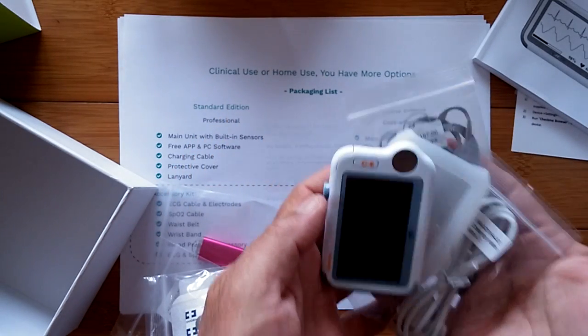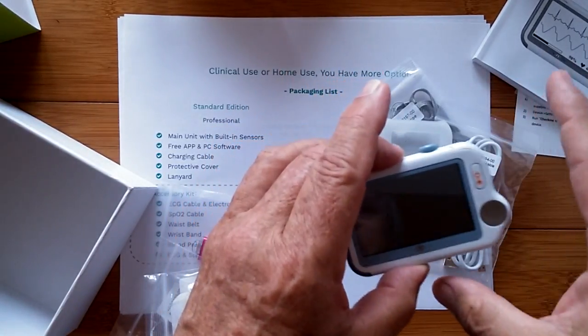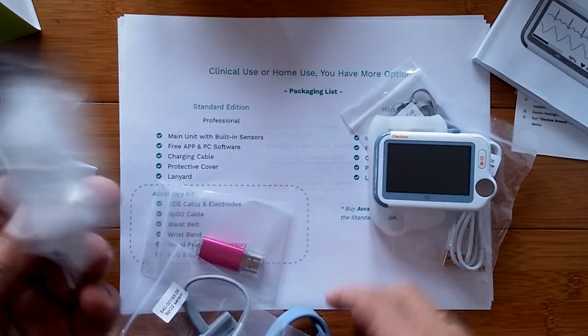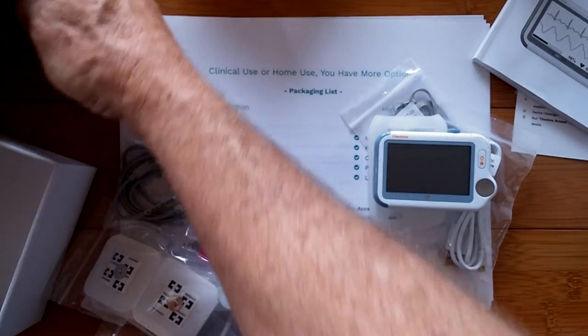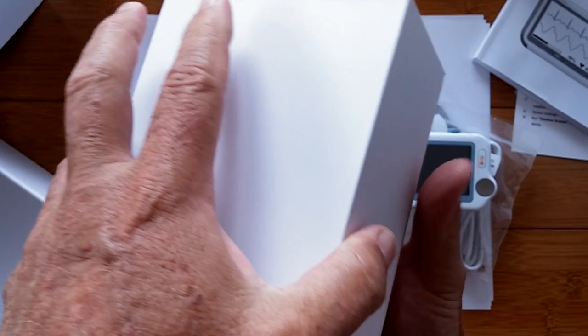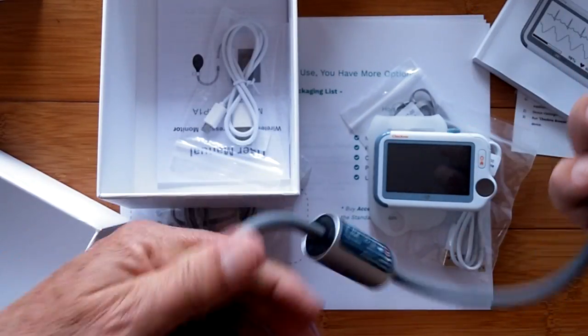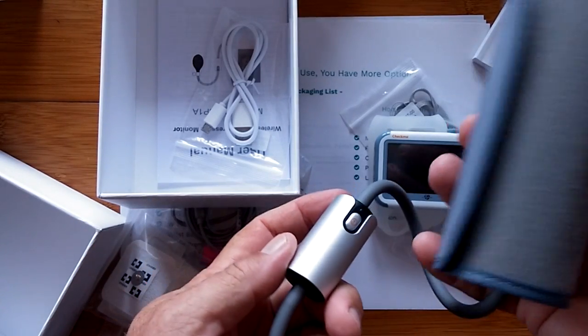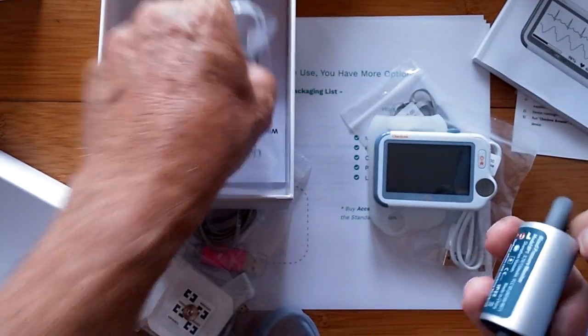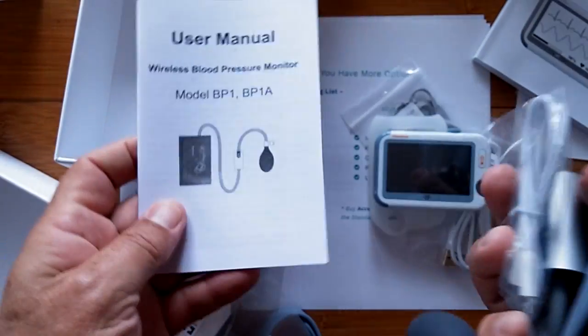When you get the basic home edition, you get all the capabilities that come with the box. As your needs expand, you can add on blood oxygen, ECG, or — in the other box — the module for doing blood pressure. This includes a real blood pressure cuff unit. It's very small, easy to use, manually operated, with the electronics built in, allowing it to tie together with the unit to capture blood pressure readings.